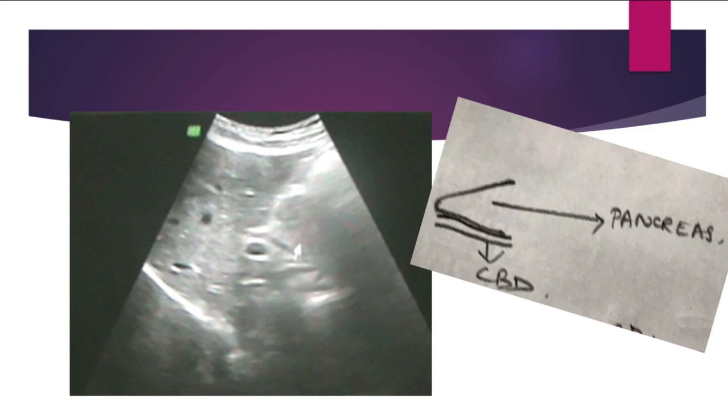And the other thing is that in order to focus the distal part, try first in short axis at the head of the pancreas, and then rotate the probe longitudinally and get the CBD in long axis, because in long axis you see a considerably longer area, and you can pick it up much more easily along the longitudinal section of the head of the pancreas.